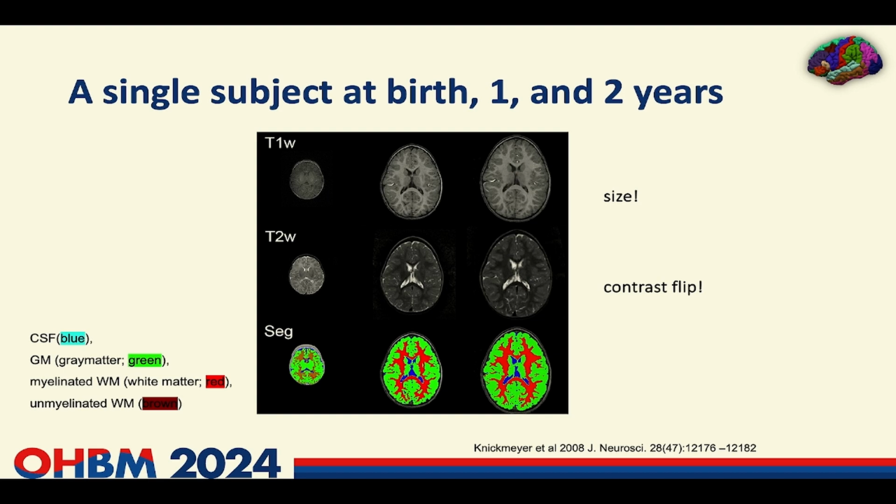So whatever is light, for example, in the T1 weighted image, the white matter in case of adults or the 2-year-old is indicated a darker color in case of a newborn. And the other way around, so the dark colored cortical areas are lighter in case of a newborn. And then also development is still happening. So your tool again, if you're writing an analysis tool, has to be robust and adaptable to that.